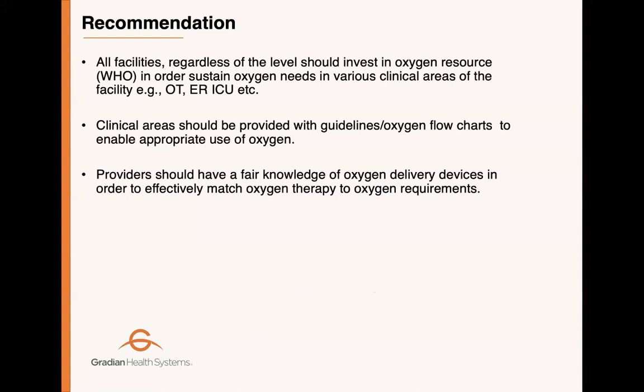So I'll take a go on it. If I understood it correctly, it's more like how often are we supposed to monitor the patient who is being treated with oxygen therapy. So I would recommend, if we are in the hospital setting with all the resources available, it should be continuous monitoring of the patients with the pulse oximeter.